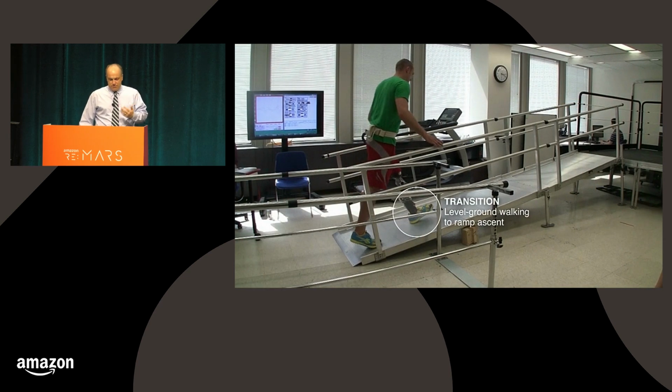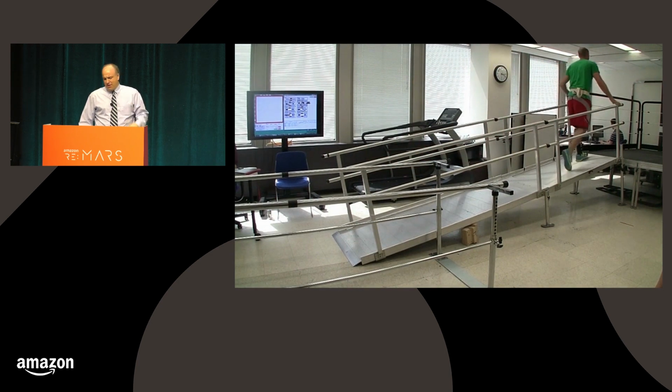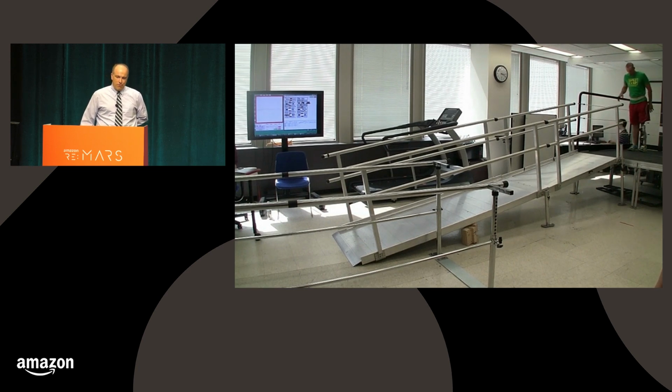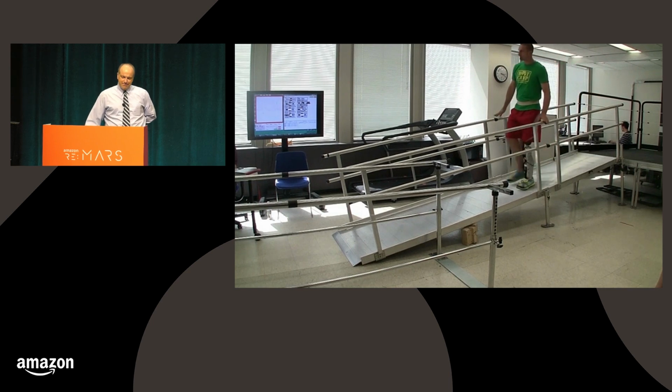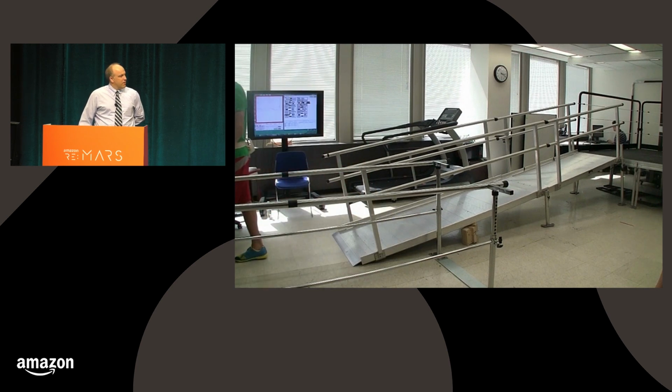Similarly, going on to ramps, a little bit less of a critical transition. I'll talk about that in a minute. But it also allows him to have a more natural gait going up and down ramps. And finally, one last transition from walking down ramps. This is, in fact, the hardest one to learn. Very difficult to get that first step on the ramp. To predict the difference between that and walking is very challenging. And then back to walking. So those are what we're focusing on to start with, and also standing, which I haven't shown in here, but we also allow standing and shuffling.